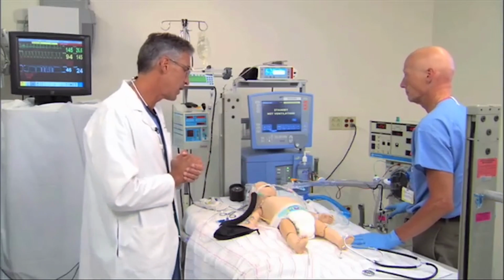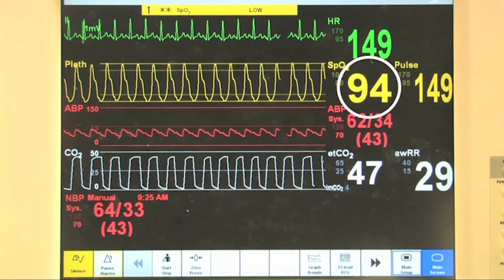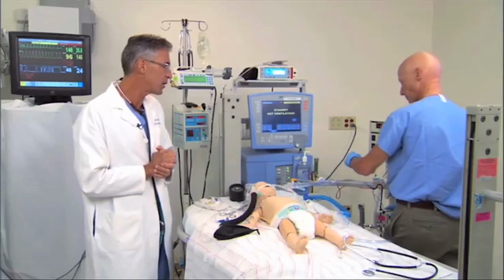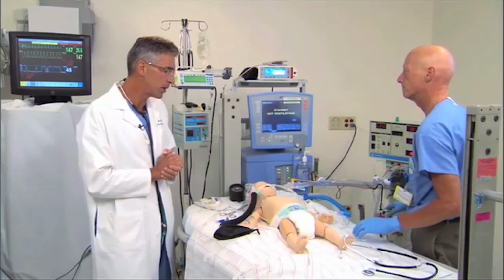We've sent a blood gas, and we're now continuing to wean our FiO2. Saturation hasn't changed dramatically. It's 94%. Let's try another wean, Barry. Let's come right down to 60%. I'm pretty comfortable with the way she recruited manually. Okay, that's 60%.